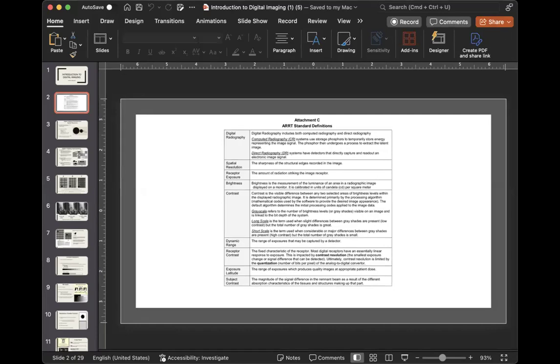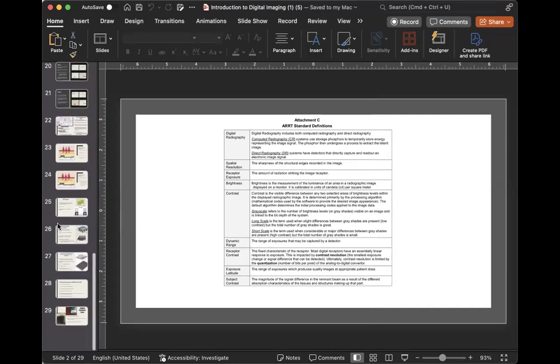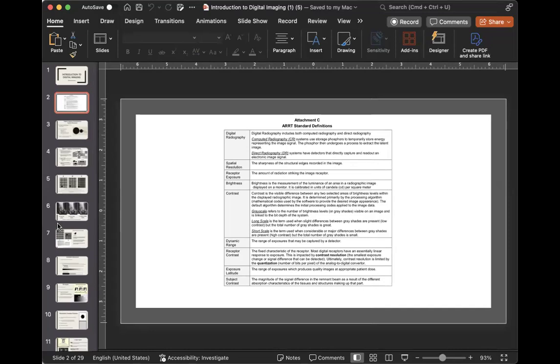And so when we talk about things like digital radiography, computer radiography, direct radiography, all the terminology needs to be assessed. Whenever you hear the term CR, that is computed radiography. When you're looking at direct radiography, DR, those are the systems where we get an instantaneous readout. There are differentiations between those two systems, right? And we're going to talk about those later.